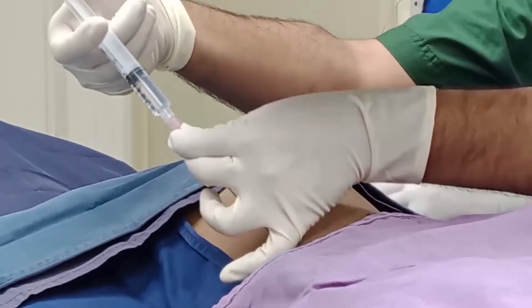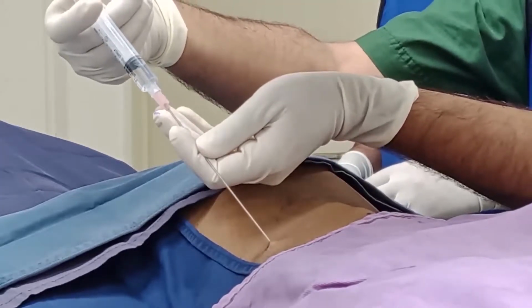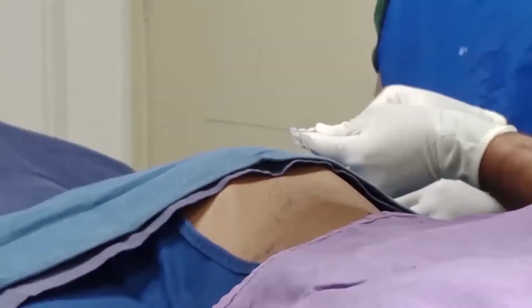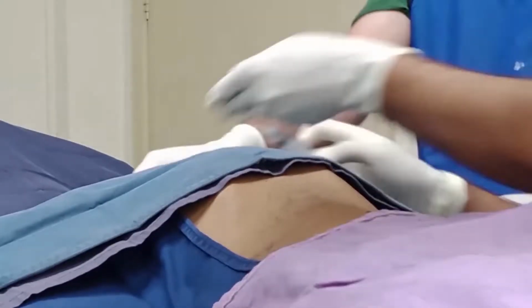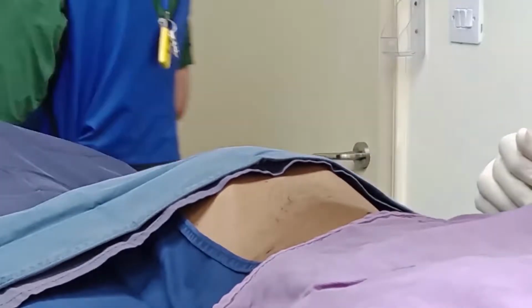The alcohol is quite painful, therefore one has to be careful about movement of the patient at this time. 2% xylocaine is being infiltrated along with taking out the Chiba needle. It is to ensure that the alcohol is not left in the withdrawal track of the skin.